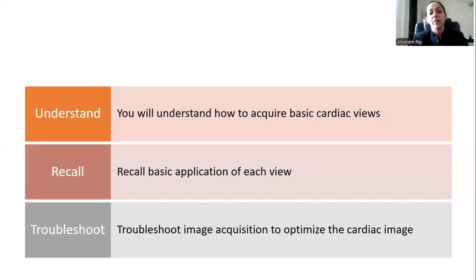So this brings me to the fact that I hope you're able to understand how to acquire the basic four cardiac views. You will be able to remember the various applications of these views, and you will be able to troubleshoot the common problems that we encounter while getting these views.